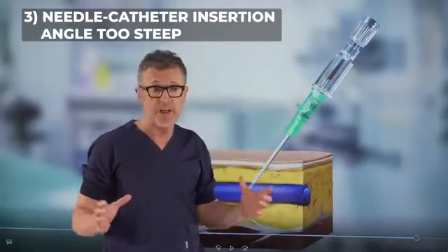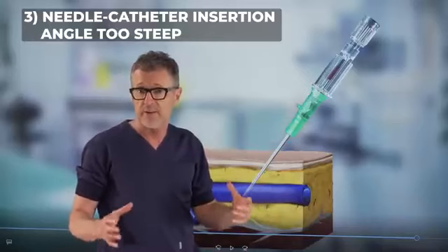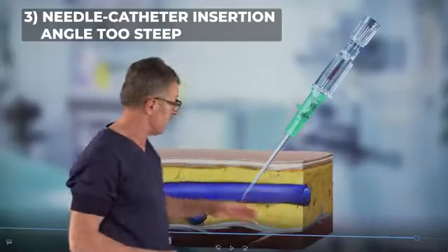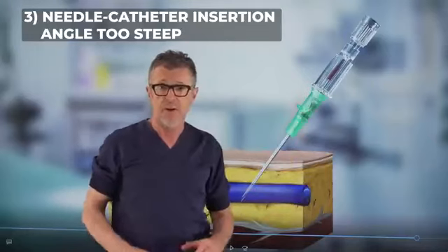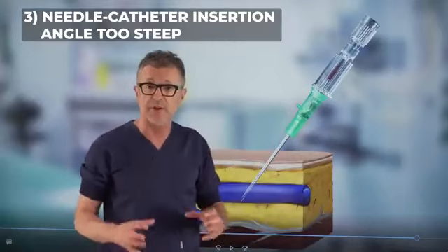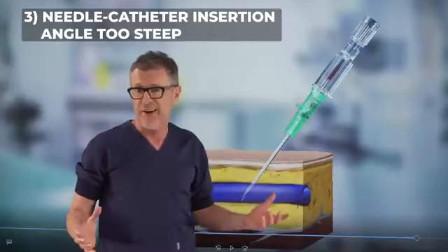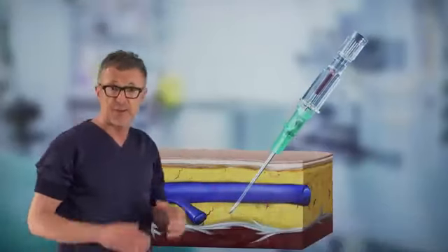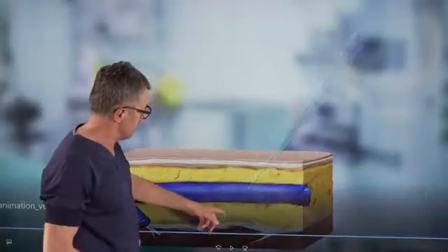So the operator thinks, okay, we're there, and now what we need to do is advance the needle catheter system a little bit deeper so it is inside the vein. Unfortunately, this high angle will prevent the operator from advancing it at the angle at which the catheter and the needle will stay inside the vein. The needle catheter passes through the vein, and then the attempt to feed the catheter clearly will result in a catheter placement paravenously.